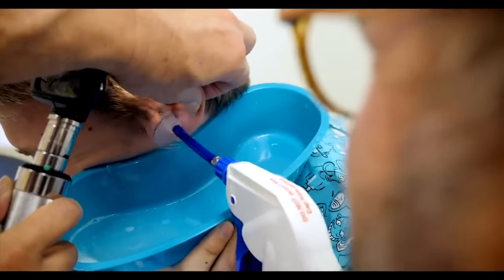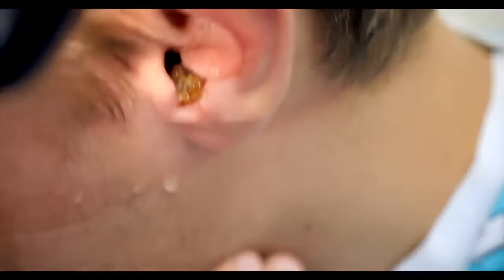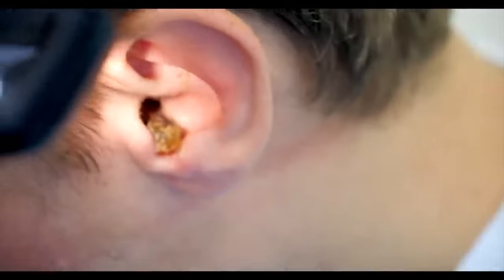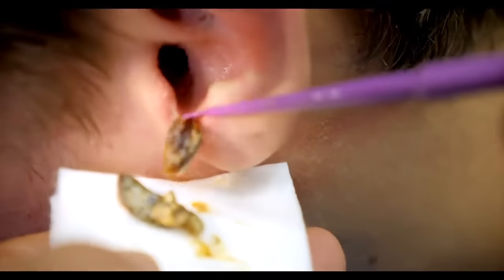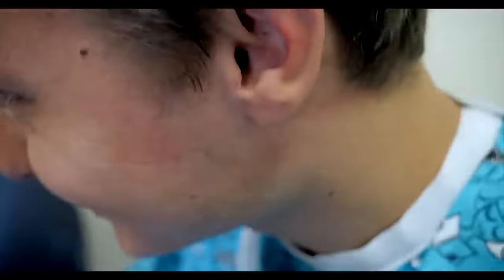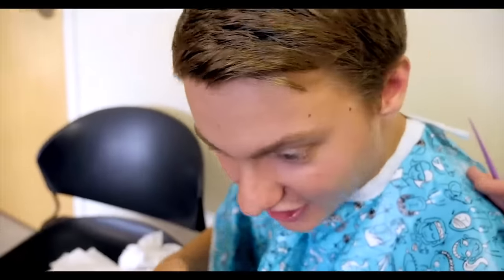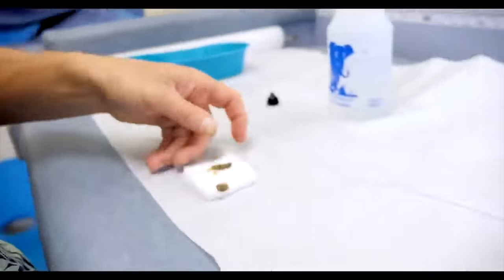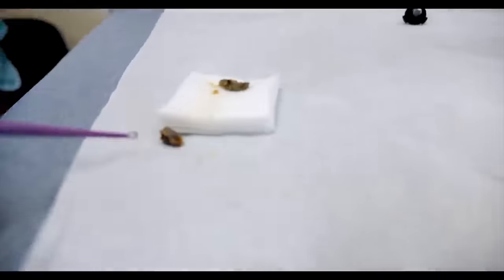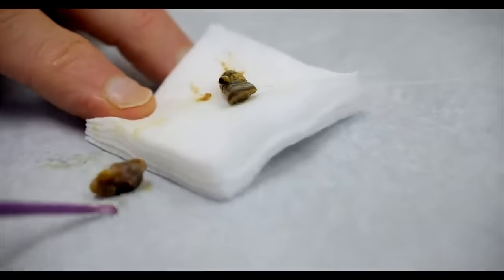We're getting there. There it is. Dude, Max has a brother — we got a brother for Max. So we'll get Max's brother over here because they want to come and welcome each other to the world. There it is — they're twins. We knew they'd find each other. Look at this. Wow, nice. You're not going to throw up, are you? No. Get little Maxwell up there — Max Jr. Come on, get up there. Quit playing with your food, get up there.